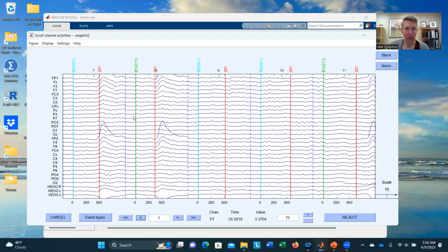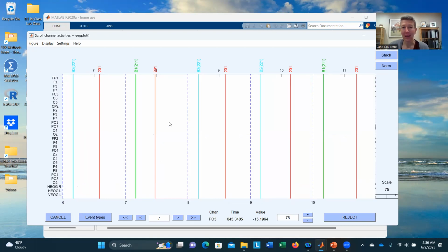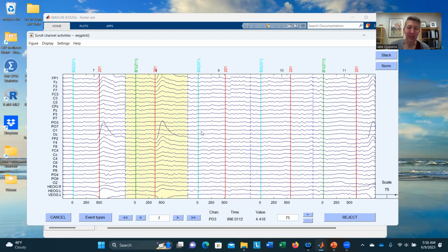But so for example, here's the start of my trial. Here's my stimulus. That's what these numbers are. So this happens to be a stimulus presentation. These ones I happen to know are from a response. And so what I might say is, actually, I have my pre-stimulus window and post-stimulus window, and this blink is occurring after they respond, and I don't actually care about that. So I might initially say, oh, it's a blink, but then I might decide, I don't actually care. So I'm going to unclick it and unselect it.